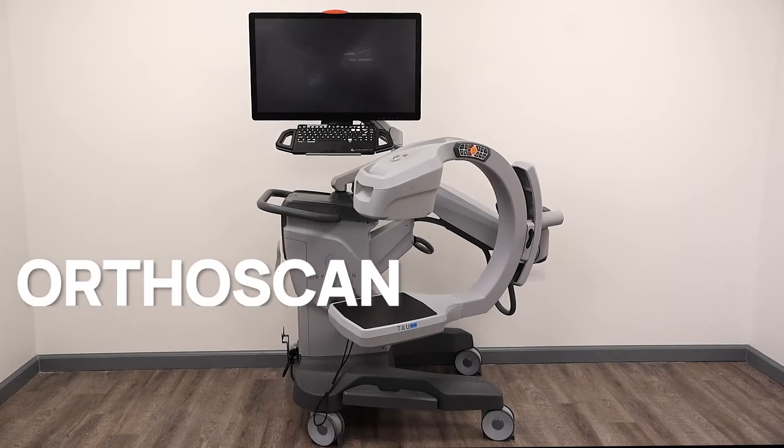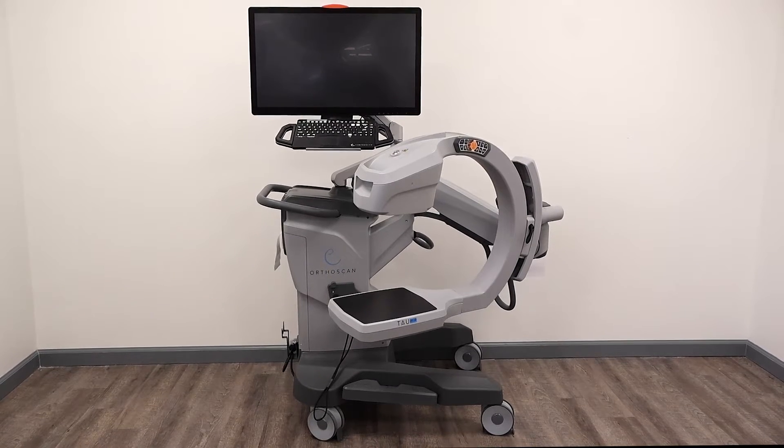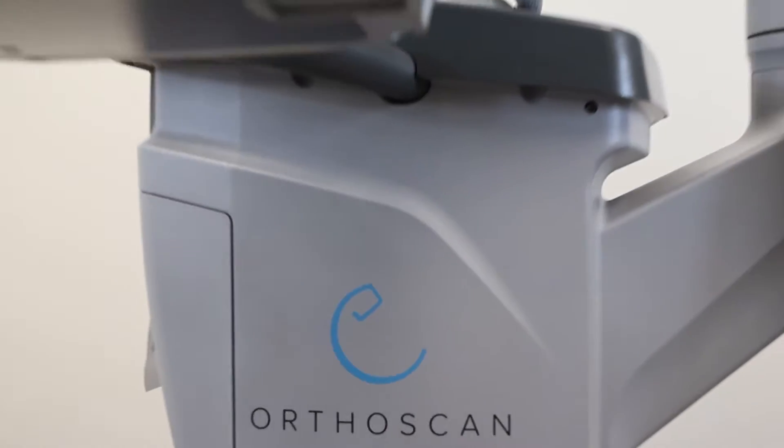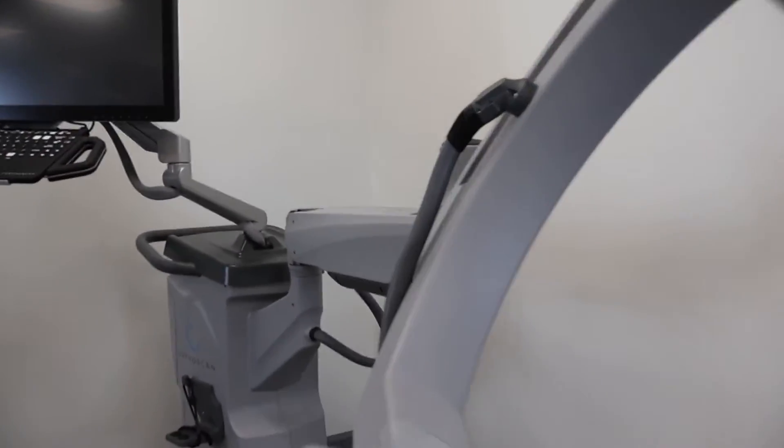Introducing the OrthoScan Tau 2020 Mini C-Arm. The OrthoScan Tau 2020 is a mini C-Arm that features improved articulation, advanced user interface, and intelligent dose reduction.